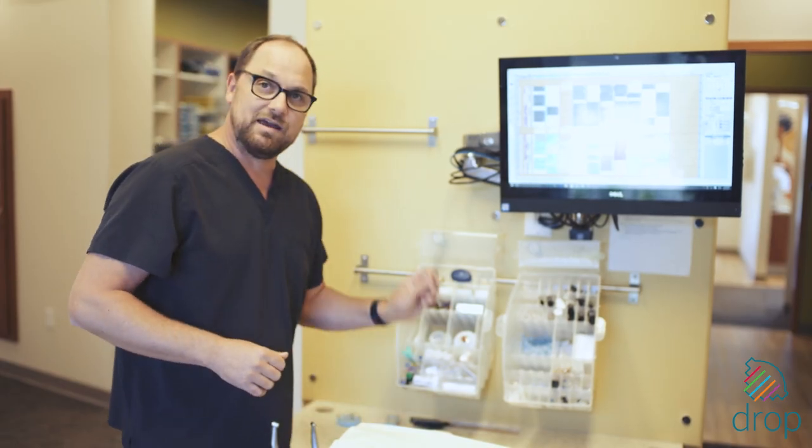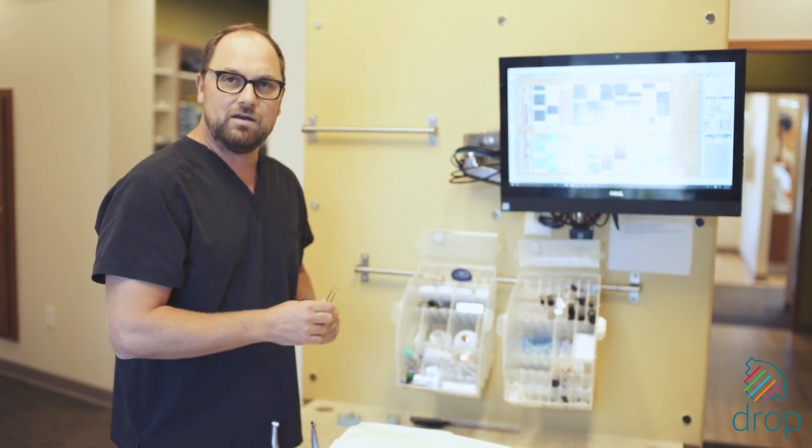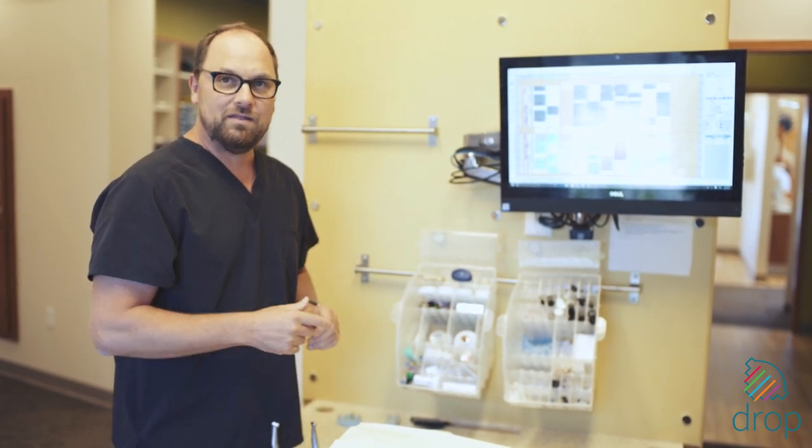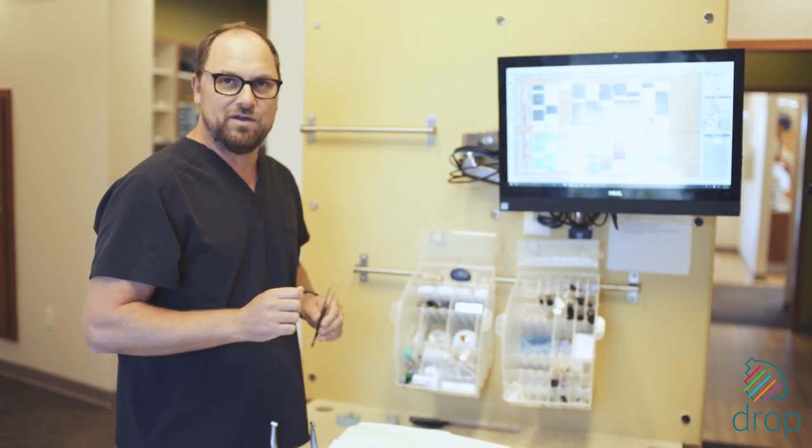And lastly, always have a set of cotton pliers handy so you can handle your materials and not have any cross-contamination. This is a great organization system for your practice to be as efficient as possible with every procedure.